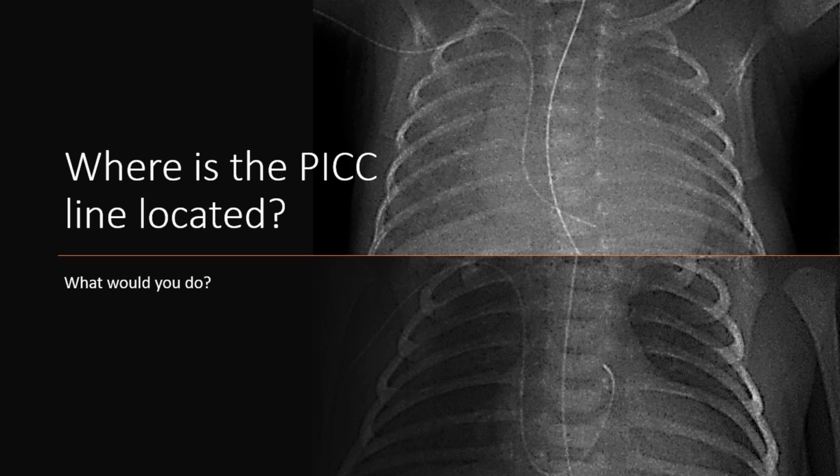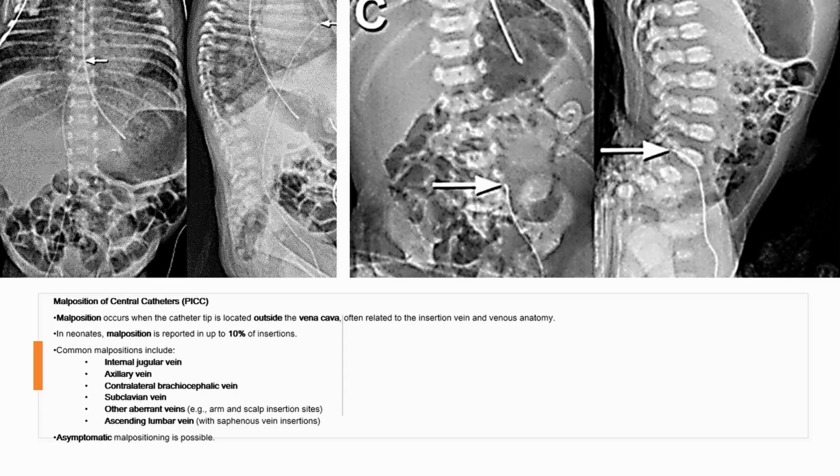What do you think of this view? Is the line in the right position? What would you do? In these pictures are examples of malposition of central catheters, PICC.